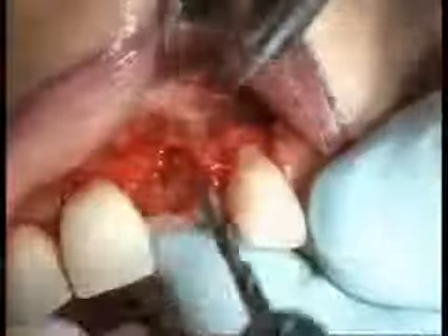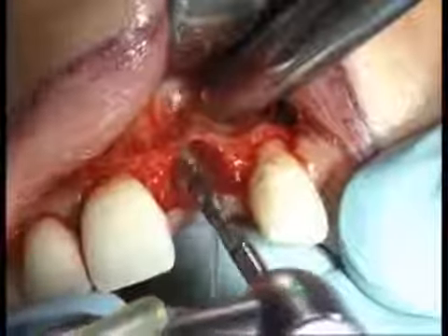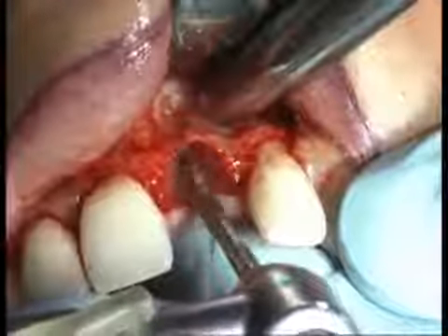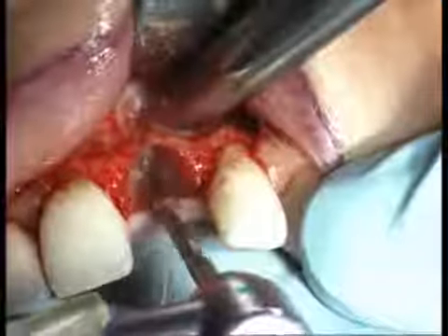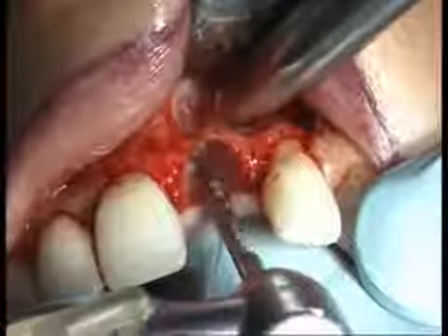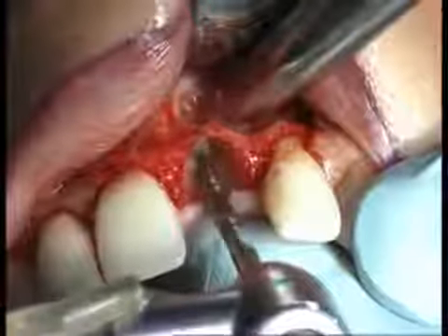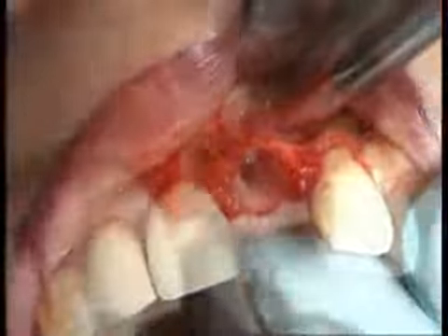Using the 2.2 mm pilot drill, the implant axis is repositioned slightly distally relative to the extraction socket, and at the same time, the preparation is extended further palatally. This procedure ensures good primary stability of the implant, since the implant axis is not identical to the direction of the extraction socket.